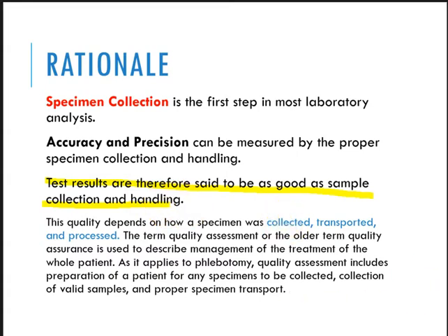Kay if for example, you made a mistake in collecting the blood, ang mahitabo, there are factors also that will contribute to the analysis or the results of the patient. So that's why it is important to collect your specimen with proper care and religiousness.